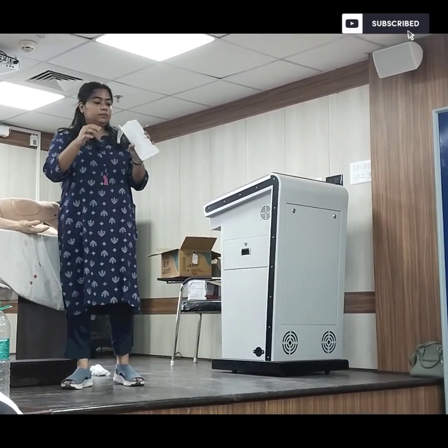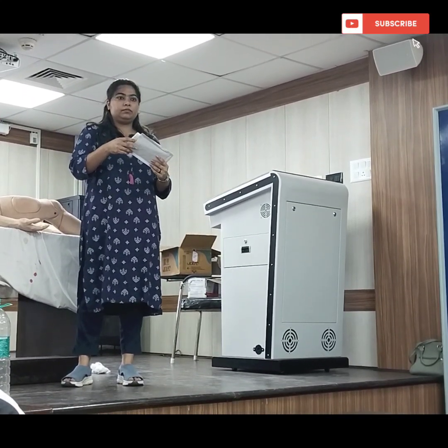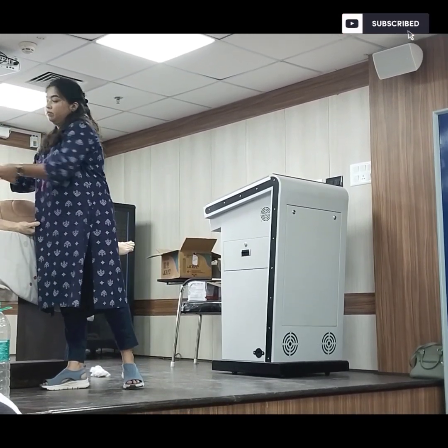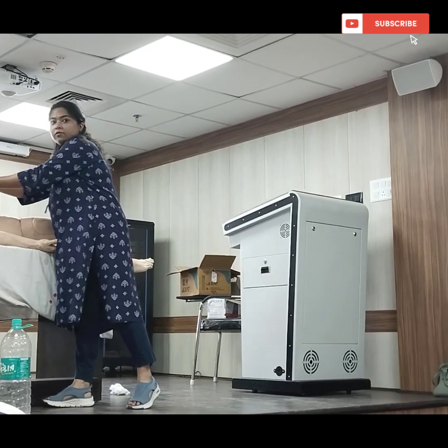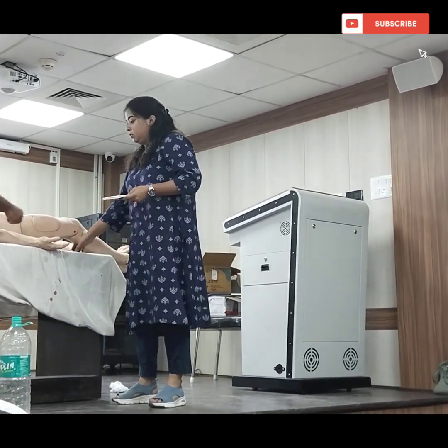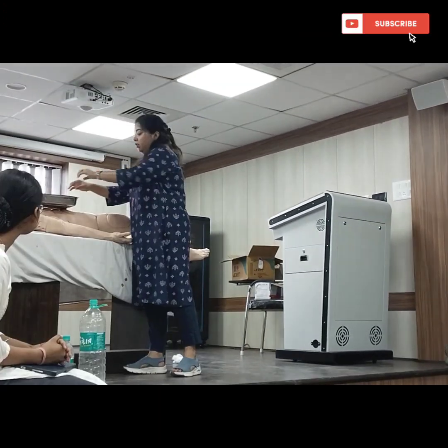The procedure that we follow is, if I am the assistant, I will be taking the gloves, I will be opening the gloves, and I will be dropping the gloves in the sterile tray. The inside part, this part is sterile. Okay, so she can touch it with her hands, right? And after that, she will be donning the gloves. When you are given the sterile tray, you will be given in this position. So the gloves will be put right here, like this.